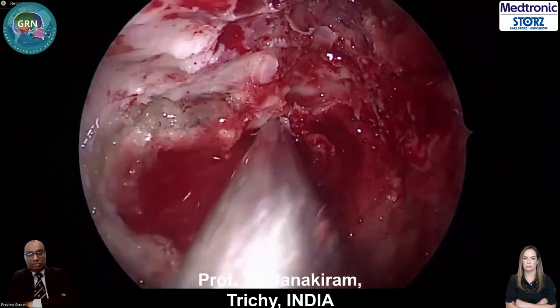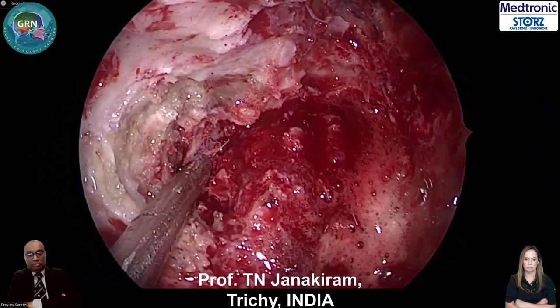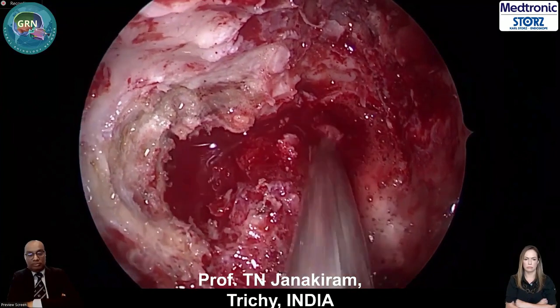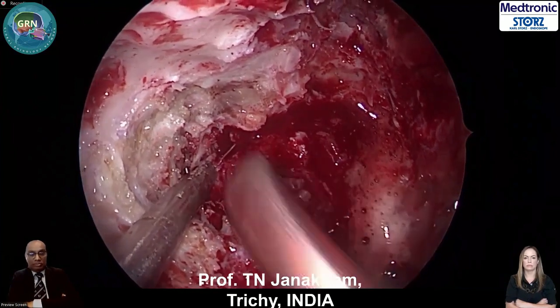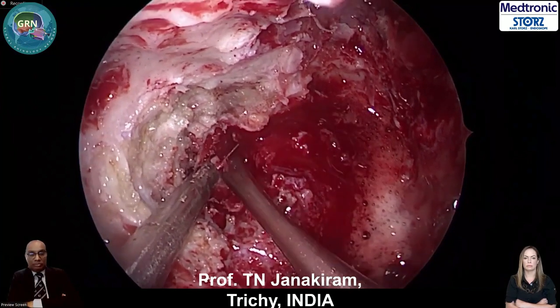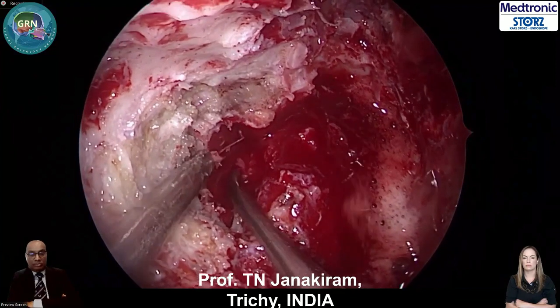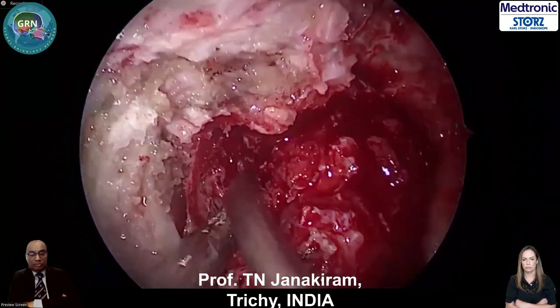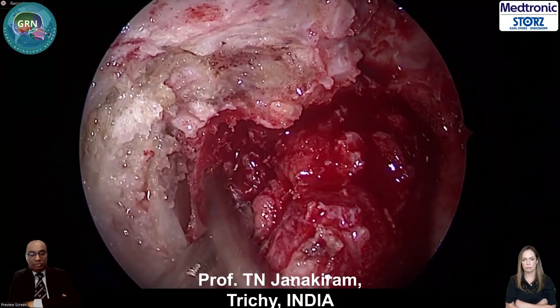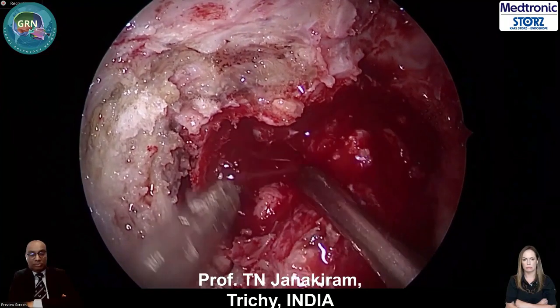Okay. Now, having done that, now I'm going for the tumor excision. Give me an elevator. So we have a few maneuvers, some tricks. So get me the Takahashi also. Big elevator. So that is the area where it is attached to the pterygoid wedge. There's the pterygoid wedge part of it. Give me a Blakesley, please.